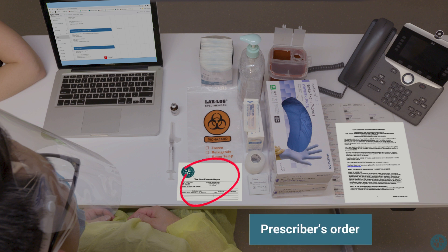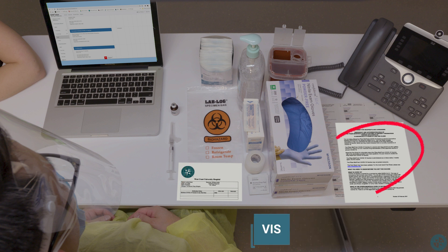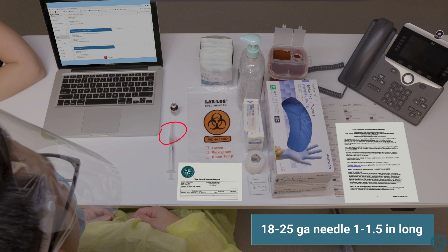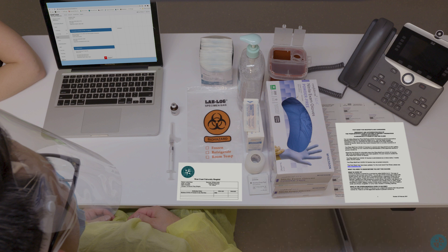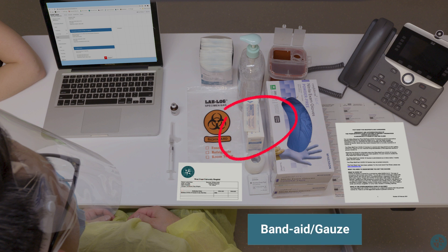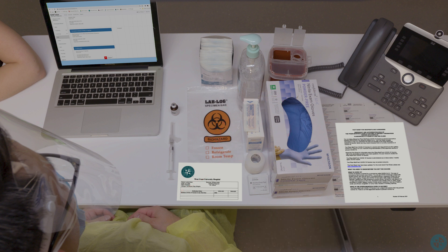Required supplies include: the prescriber's order, a vaccine information sheet to educate the patient, the patient's medication administration record, any necessary medication, alcohol pads, an 18–25 gauge needle that is 1-inch to 1½ inches in length, a 1–3 milliliter syringe, a band-aid or gauze, and tape.